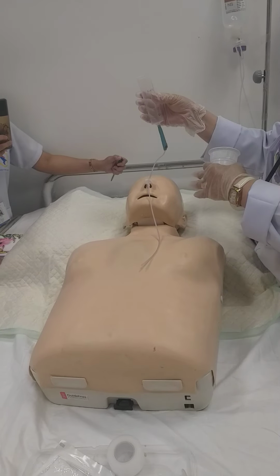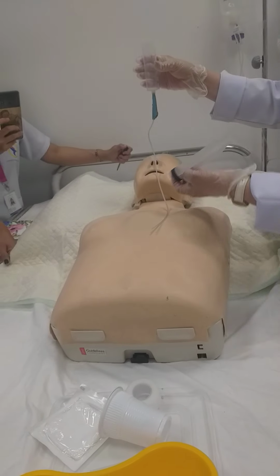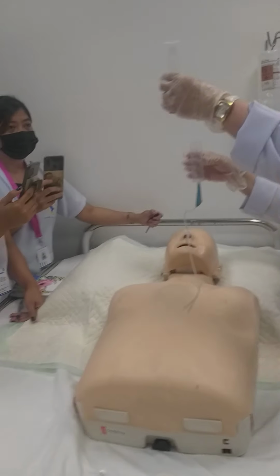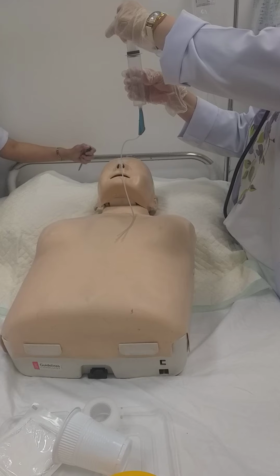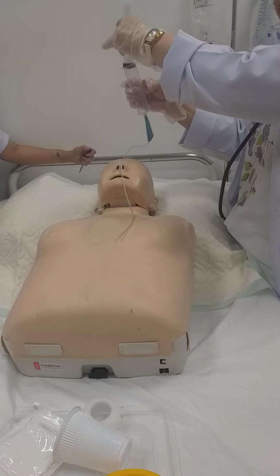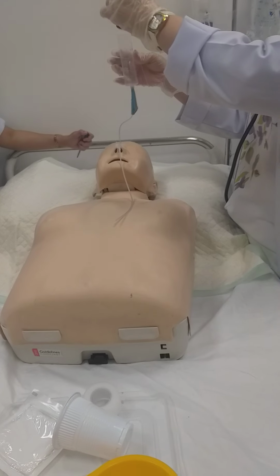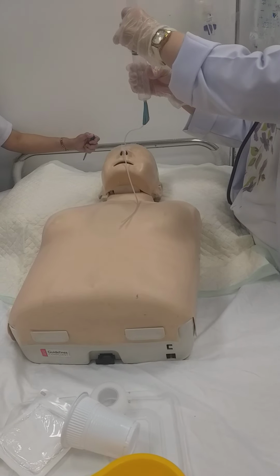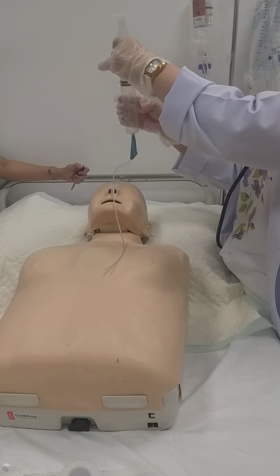There is no blockage. If there is any blockage, you did like this and it doesn't go with the gravity, use the plunger, just push gently. Okay? Not too much. Gently only so that it will go. So if it doesn't want to go, you have to push it harder. But if not, just a gentle touch.